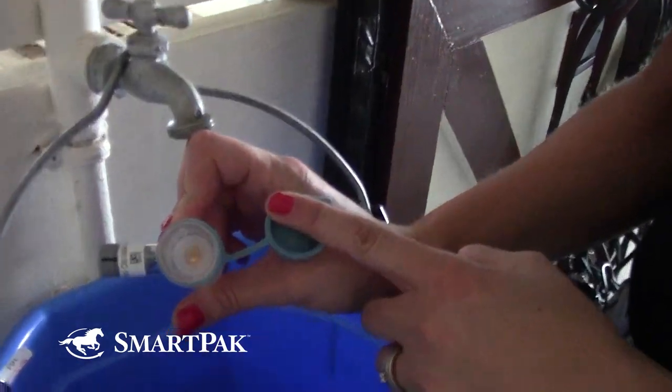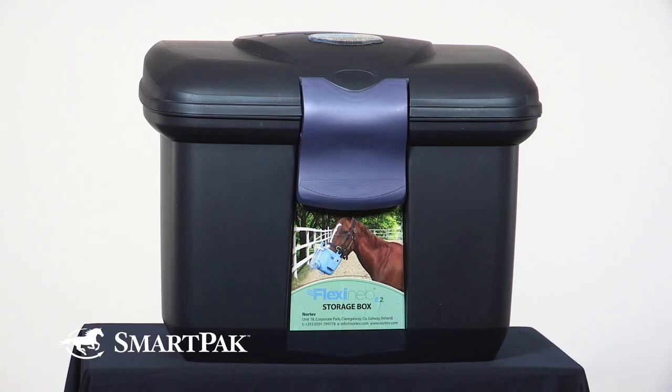The soft shell mask is very easy to clean. You can just use water, or you can also add some dish soap and just clean it in the sink or wherever you have space in your barn.